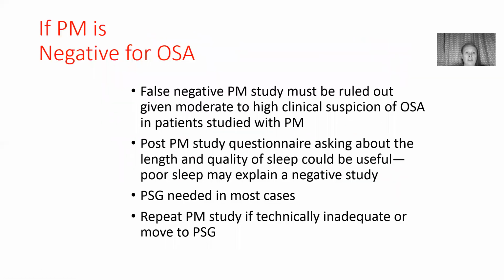If a portable monitoring test is negative for sleep apnea, there's some things you should consider. A false negative home study must be ruled out given moderate to high clinical suspicion of sleep apnea in patients studied with portable monitoring.